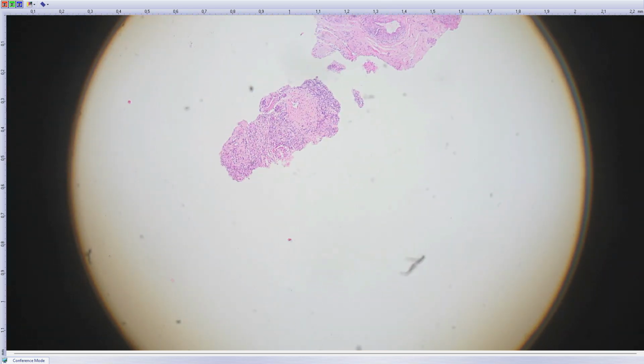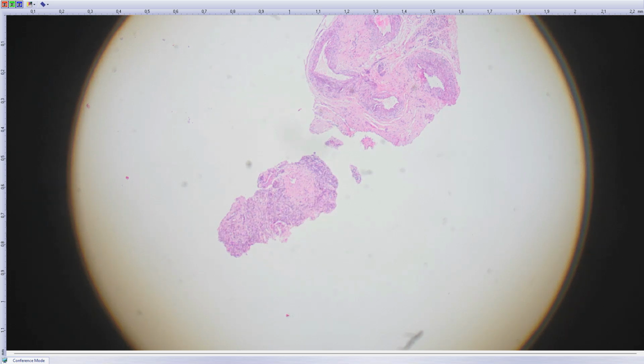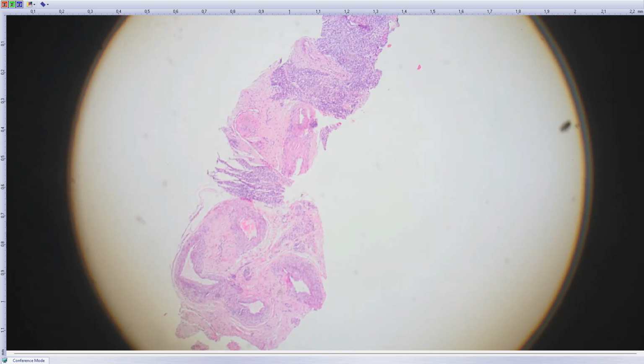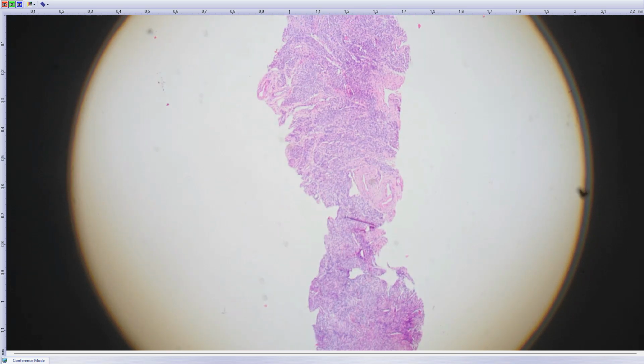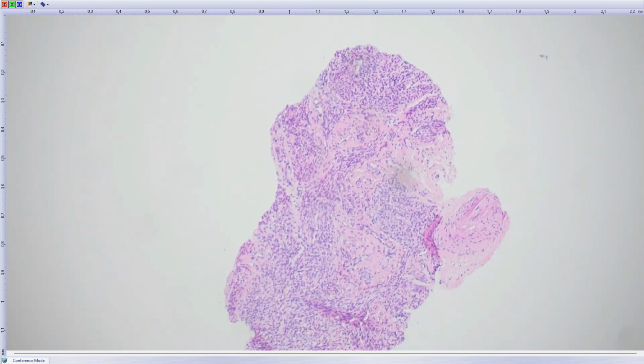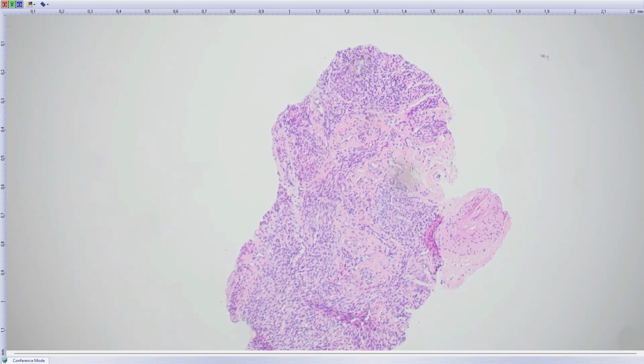Okay, another case was a 70-year-old lady with multifocal peritoneal nodules, which were thought to be metastatic lesions, and she was supposed to have some GYN tumor, most likely an ovarian tumor. Also she had a large cystic liver lesion of like 12 or 15 centimeters in dimension, so a big liver lesion at the same time.